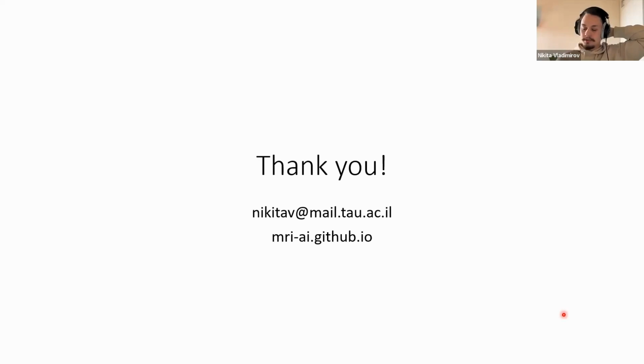I know that there is a CEST PulseSeq simulator available, but it is implemented in MATLAB and C++. There is a problem that you cannot publish it in open access if it is a MATLAB thing, because people need a license. So my first step was to implement the same. I took the C++ code, wrote some interfaces for Python, and made it available for multi-threading. So it is actually PulseSeq CEST, the same as MATLAB but in Python, and now we can share it in open access.